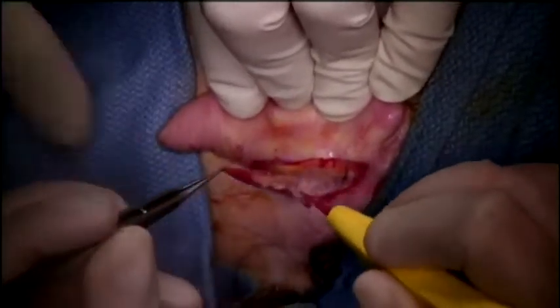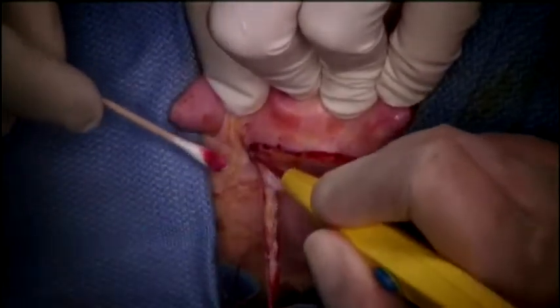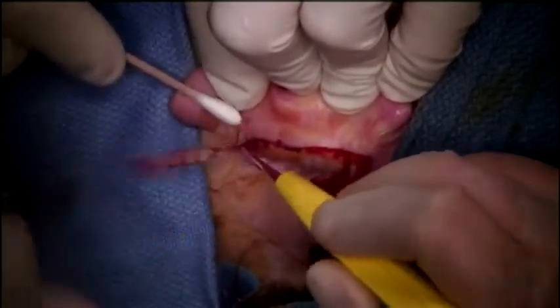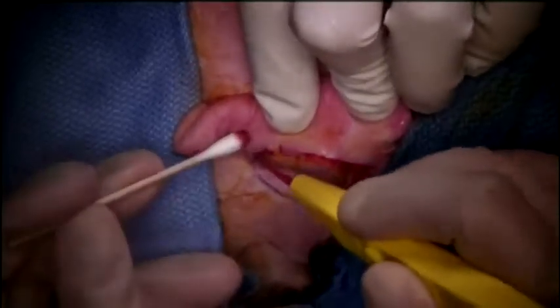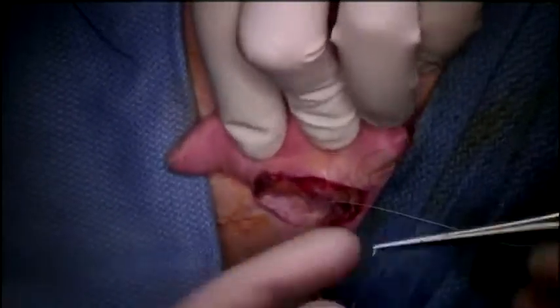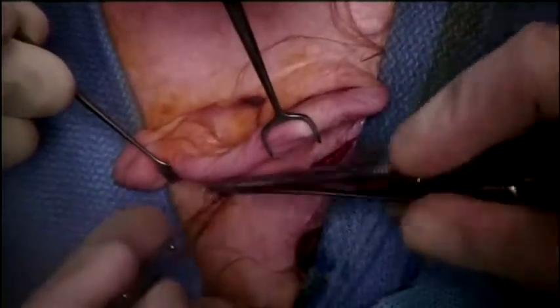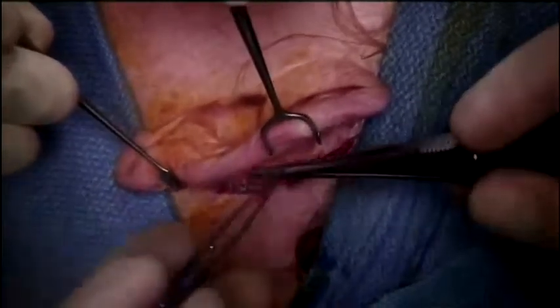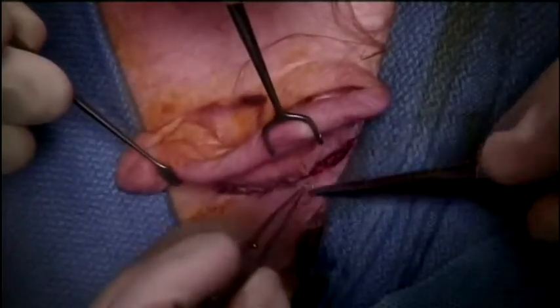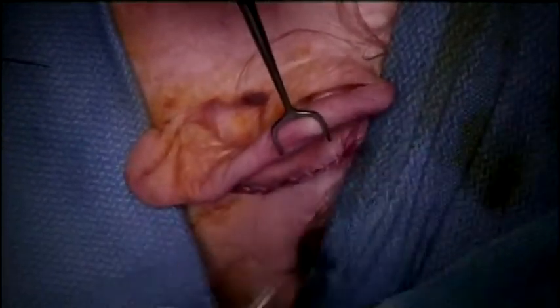Typically, this is a safe region to cut, but you do have to be careful with some of the nerves that are coming out in that region. Cautery is achieved with a Colorado tip cautery or any kind of instrument you have available. And we do an interrupted buried suture to reposition the subcutaneous tissue, and this is a 5-0 vicryl suture that I'm using. Now, once several of those are placed, I use a chromic suture. This is a 5-0 chromic in a running and locked fashion. You don't have to worry about removing this because it absorbs in about 3 weeks.